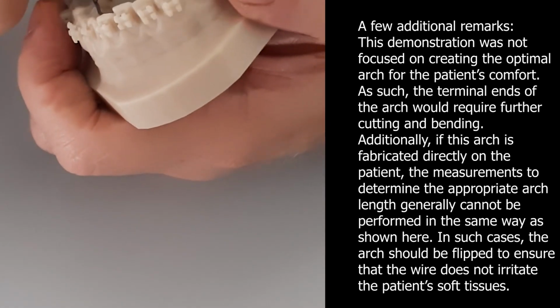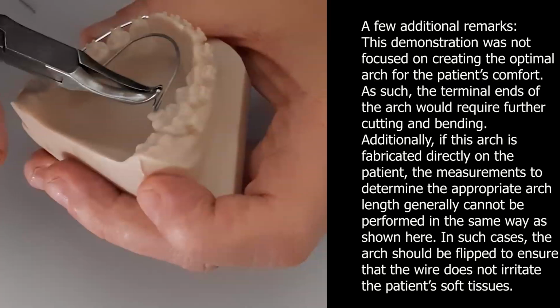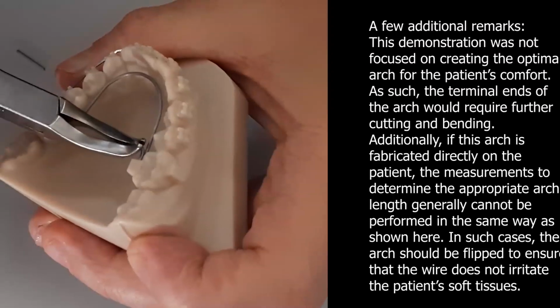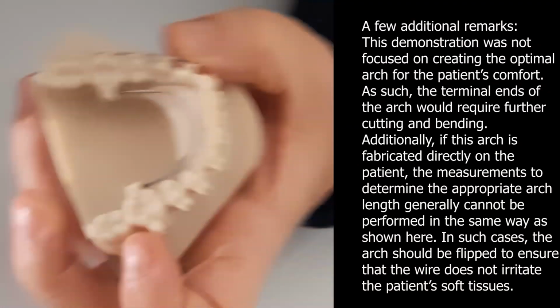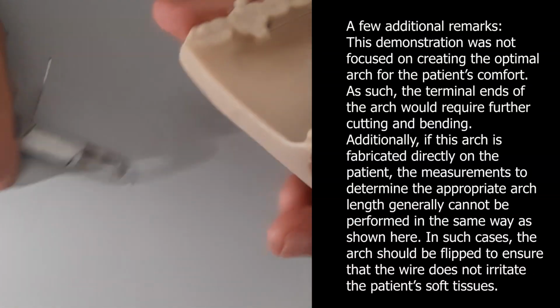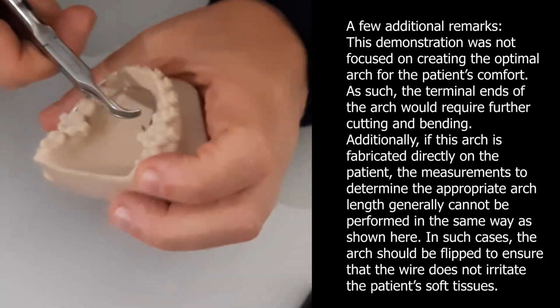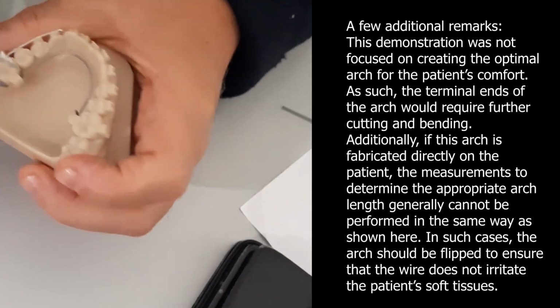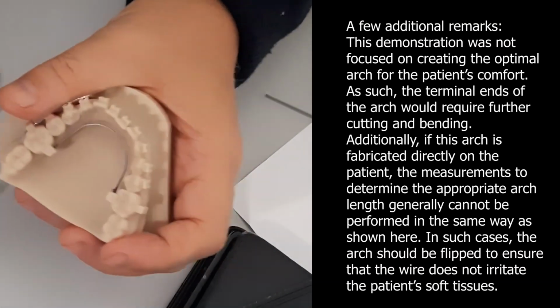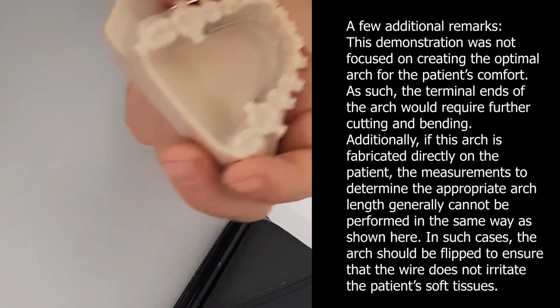Now from here, so this is it. And then you can, if needed, adjust this arch. If it's touching here, you raise it. Okay? Just simply, you make two bends here to raise it a bit.